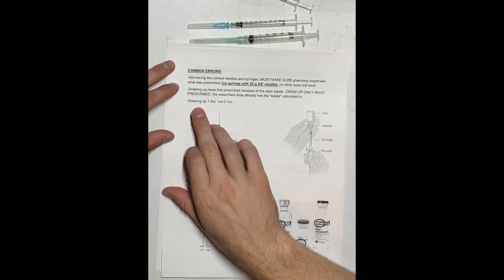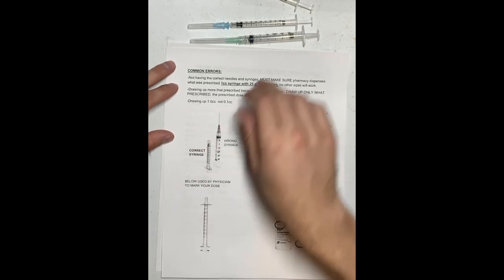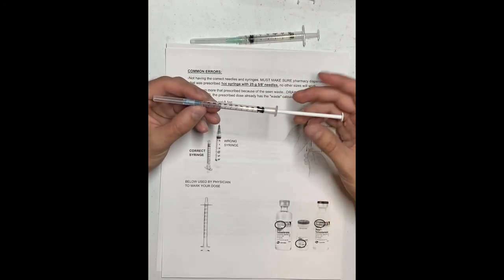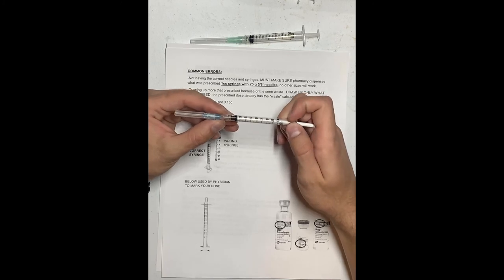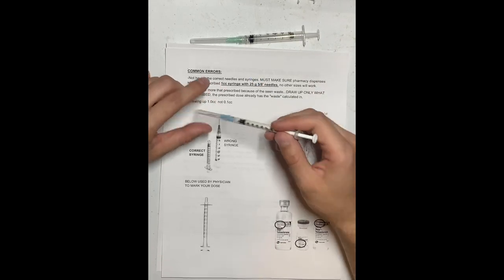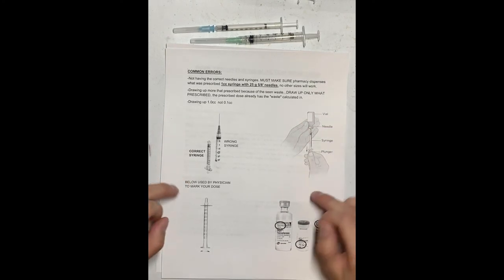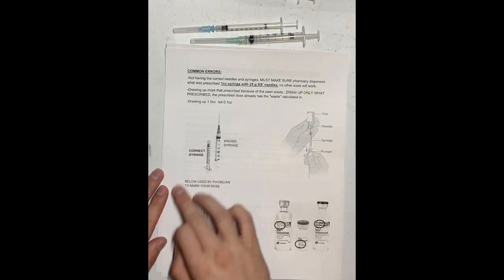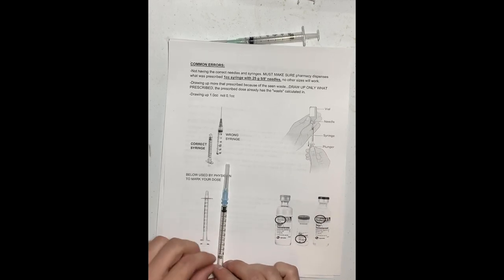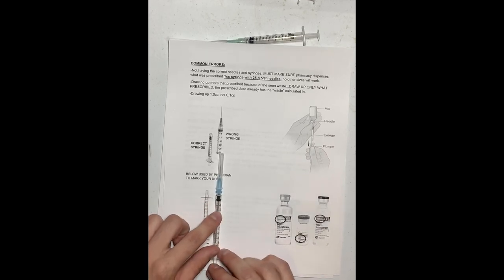Number three: drawing up 1 CC instead of 0.1 CC. You are not going to draw up the entire syringe — only draw to the 0.1 mark, or whatever your prescribed dose is. Your physician will mark on the syringe where you should pull your plunger to. Draw the plunger to that line.